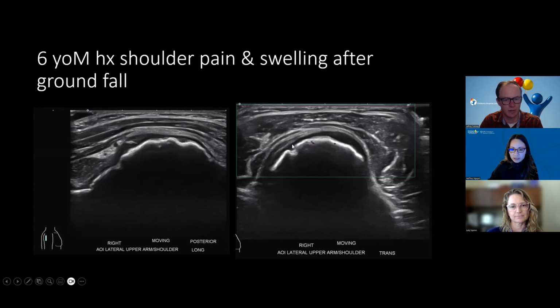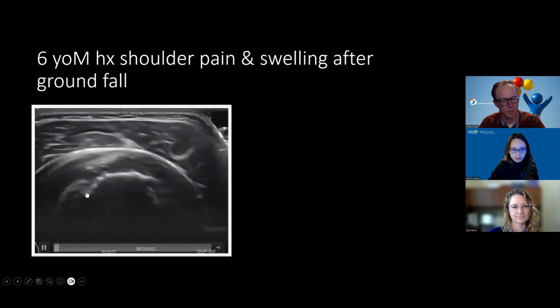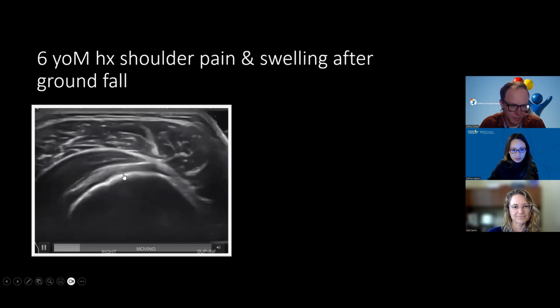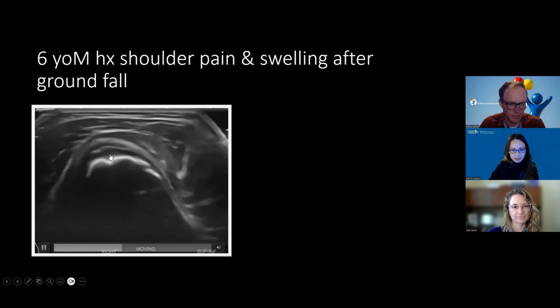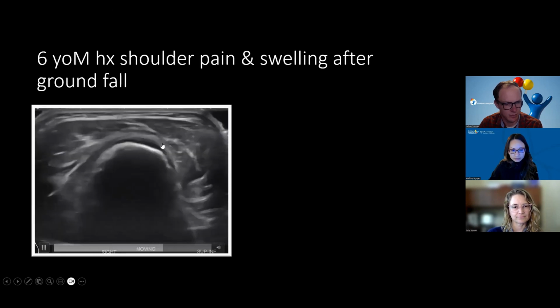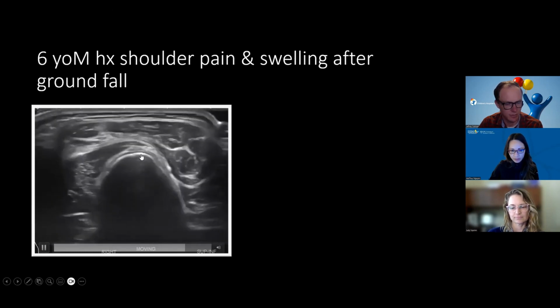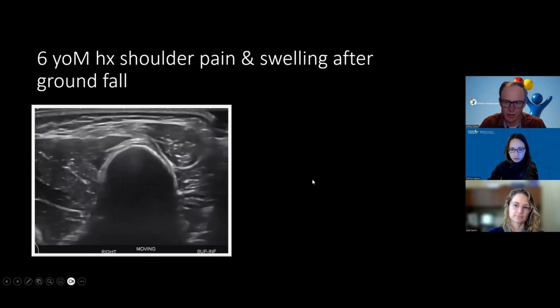And then this is what it looks like on trans. Similar, just that undulated appearance, and then there's almost a cartilage cap on it. So this is a very typical or classic appearance of an osteochondroma. And I'll let you see how the cine looks. Once again, this is that bony protuberance that we're imaging, and then you'll see that cartilage cap, and you can even measure that, and then you're back to normal bone more distally. So that's just going from top to bottom, or cranial to caudal.